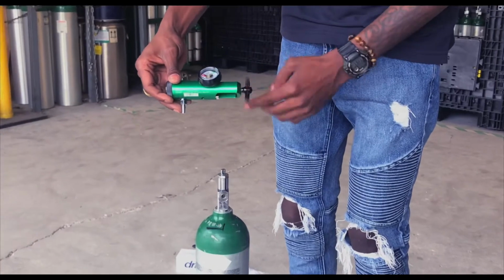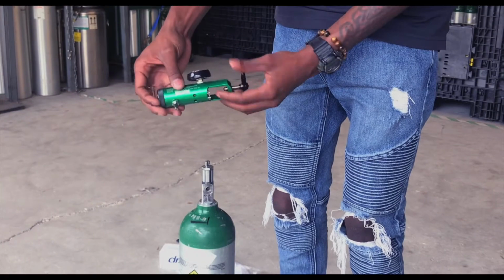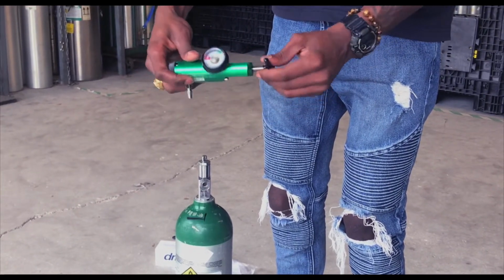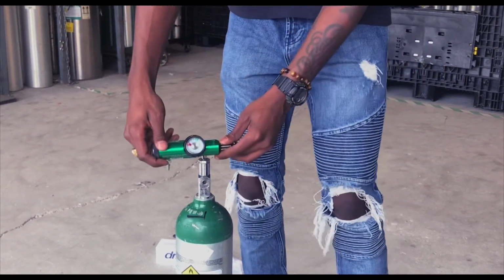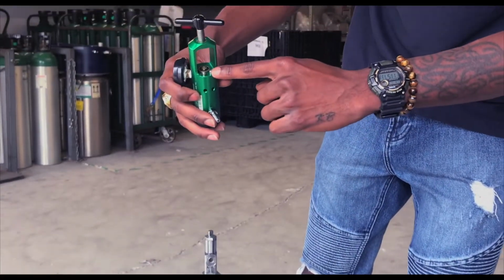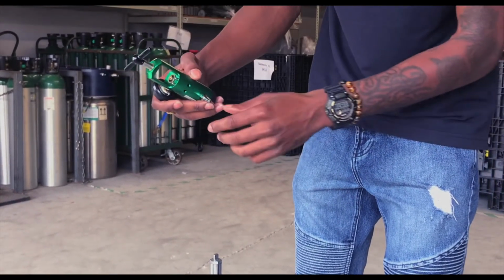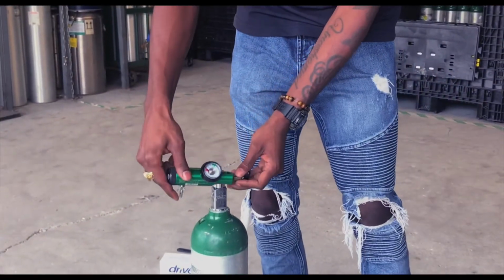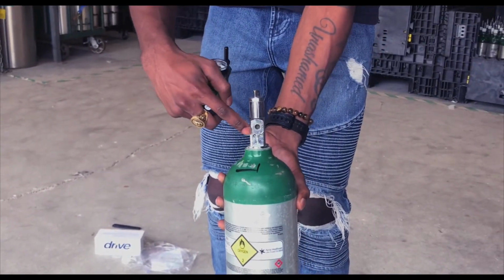So just looking at the regulator at first glance, we see a few different types of things, and it can easily be scary. So first thing you want to do is make sure that your tightening rod, this is what I like to call it, your tightening rod is all the way out so that you can put your regulator over your tank. And on your regulator you'll have 2 little prongs, that's what I like to call them, and they stick out not even that far, but they stick out just enough so you can slide your regulator over your E-tank, and these 2 prongs are going to fit right snug in those 2 holes.